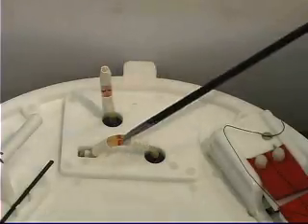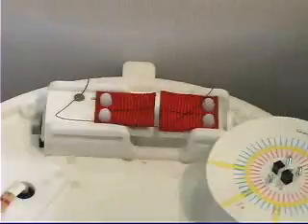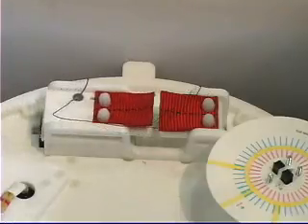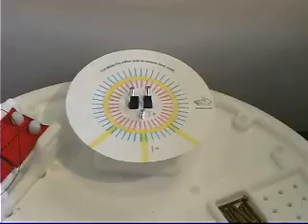The seventh task is cinching this loop around a vertical tube. The eighth task involves an extracorporeal knot around the horizontal tube. The ninth task is an intracorporeal knot, the integrity of which is verified by a built-in tensometer. The final task is to cut a circle delineated by a yellow line as shown here.